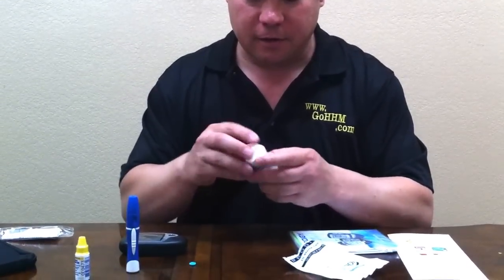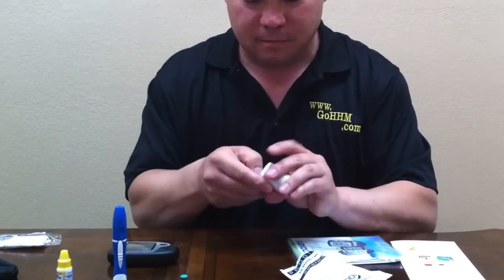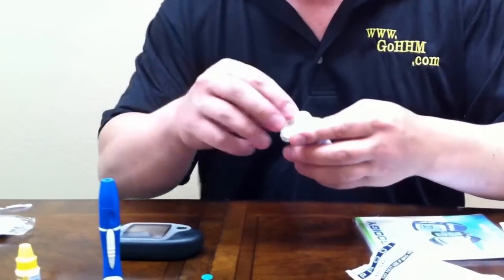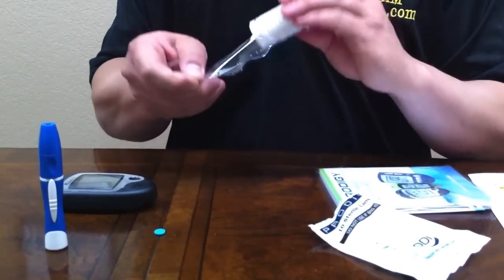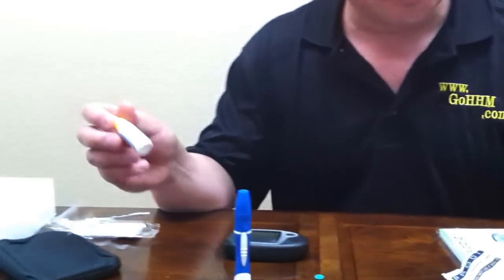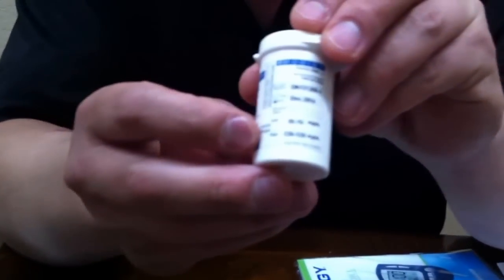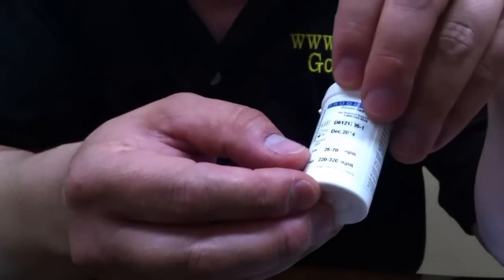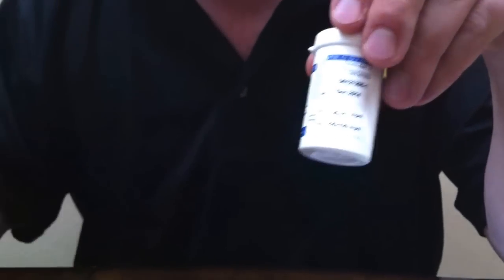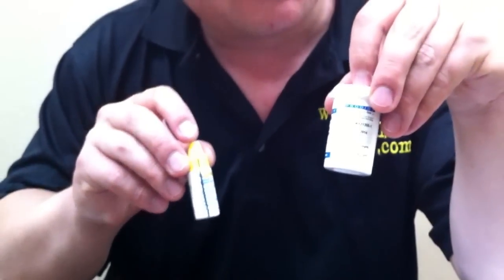The last item that we have here is, of course, our strips. Now, I promised to come back to this calibration solution. This is calibration solution low. What that corresponds to is on the side of the bottle you see control ranges — there's low and there's high. The low should be between 25 and 70. You'll test that calibration solution just like regular blood, and it should come up between 25 and 70.